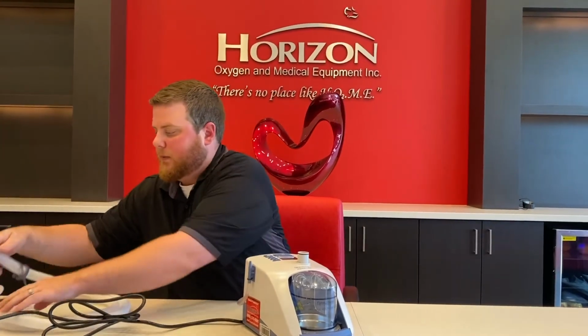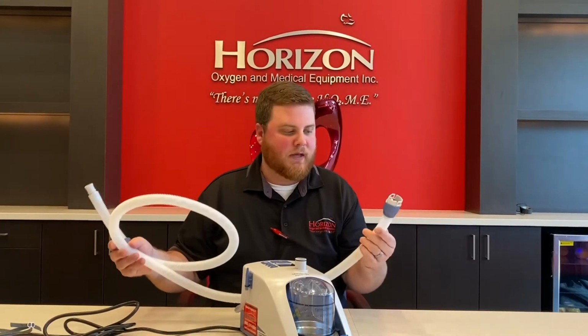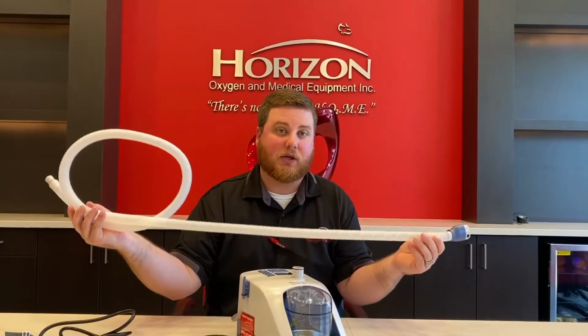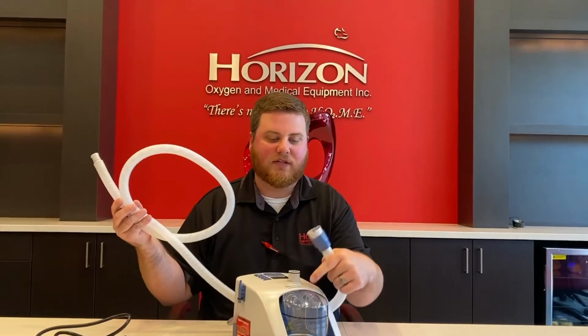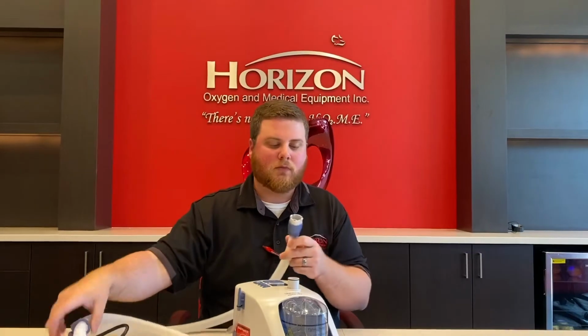At the very top here is where we connect our tubing. Our tubing looks pretty similar to our CPAP and BiPAP tubing. It's a corrugated flexible tubing. You'll notice that there are little wires inside the tubing. This keeps the tubing heated. That way, whatever temperature we set in the machine, we can maintain all the way to the patient. So in order to keep that tubing heated, we have to have an electrical system for that.